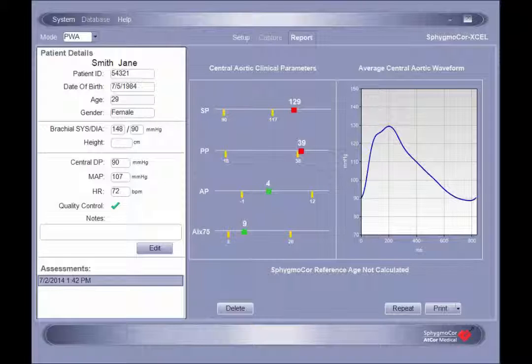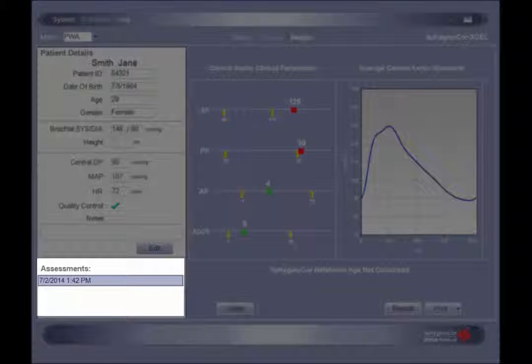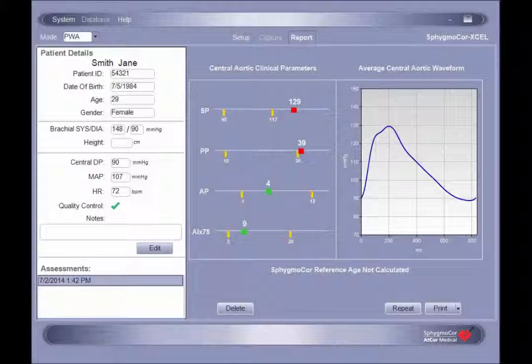Once generated, a report is automatically saved to the patient's profile. Any subsequent reports will also be added under the patient's profile and can be accessed in the Assessments section at the bottom left of the report screen. All reports are listed chronologically and identified by the date and time of the assessment.